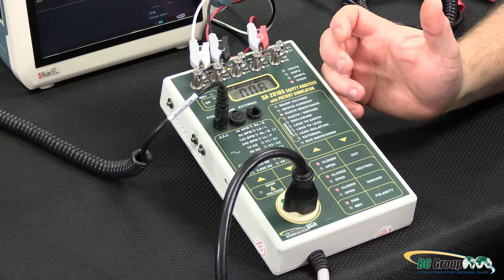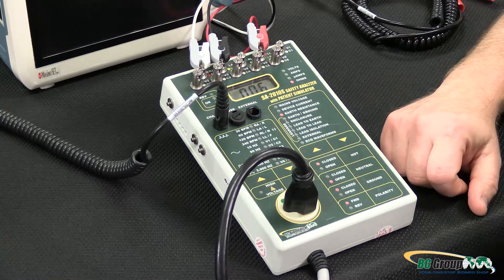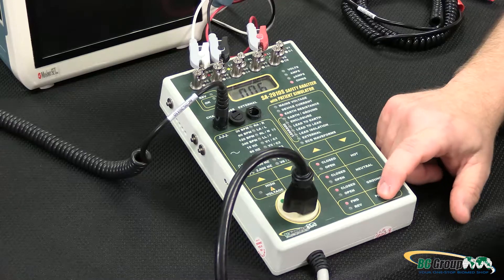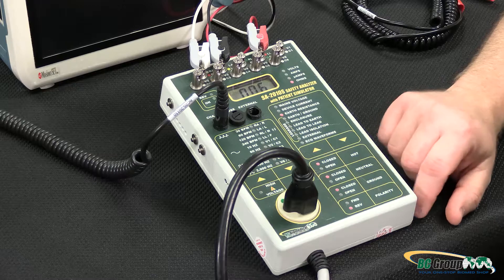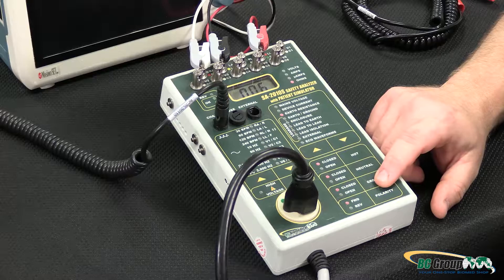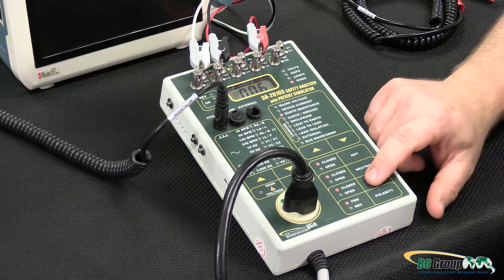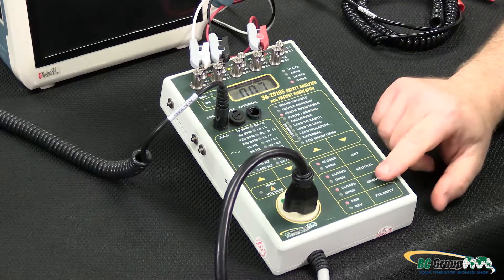We can also do this testing with open hot, open neutral, and make sure that none of these single fault conditions cause a change to our measurement on the device. So we can do reverse polarity, open hot, open ground, and open neutral. If we open the ground, we have no ground connected so we can't get a resistance measurement — so we want to make sure that when doing earth resistance we have the ground closed.